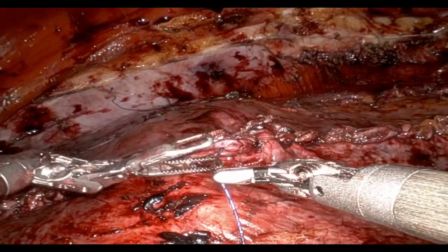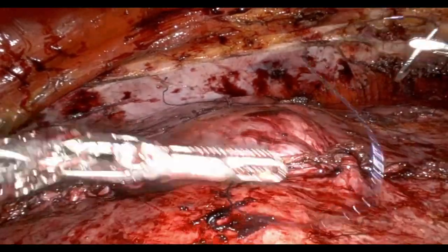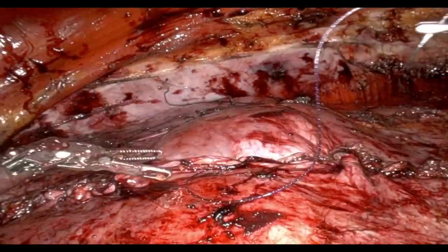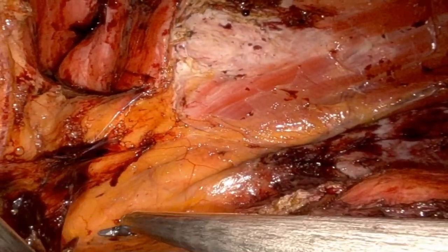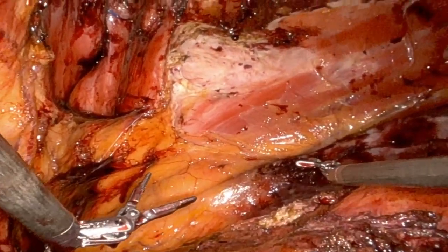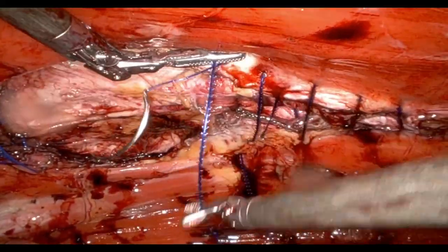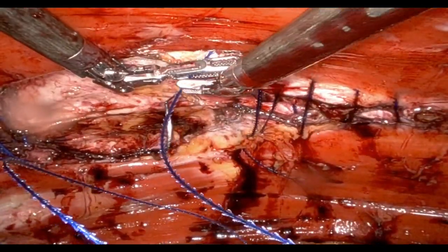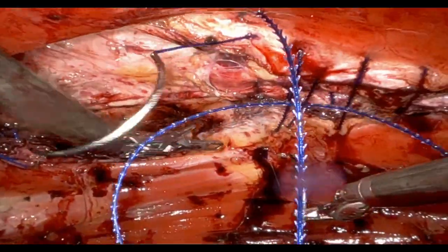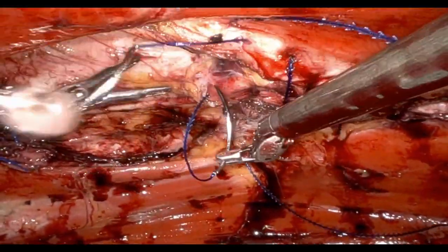An easy closure of the posterior — you can see it's flopped right over the visceral with no tension. Proceeding with defect closure, you can see we extended the dissection well into the retropubic space, and there's still a large hernia even after plicating the other hole. For this case I actually ended up using a suture I'd never used before: Stratafix. Our hospital informed me mid-case that we were out of my standard number-one permanent V-lock, and the scrub recommended Stratafix.